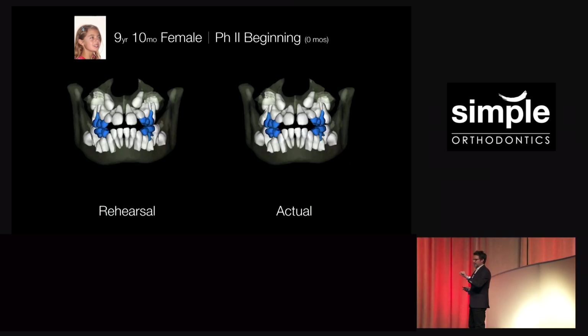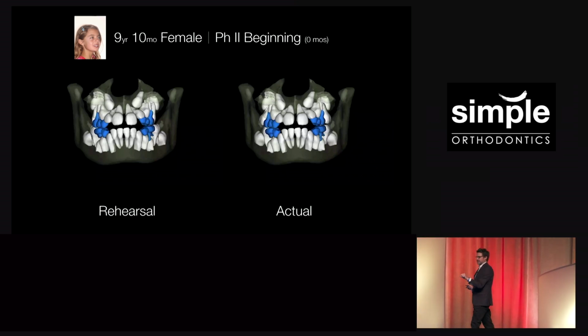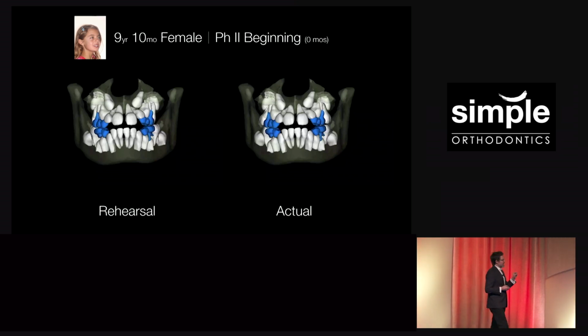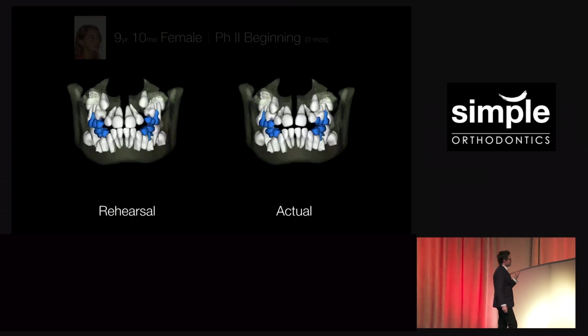So this is what Dr. McNamara is talking about, study. What did we do? Did it work out like the rehearsal? Or do I have to go back and start modifying my rehearsals because teeth and bodies respond differently? Here's the difference.